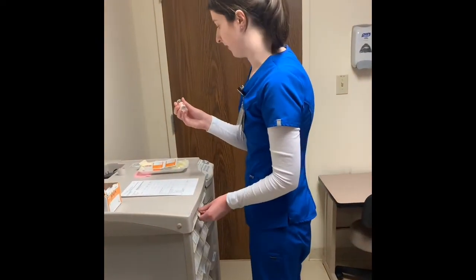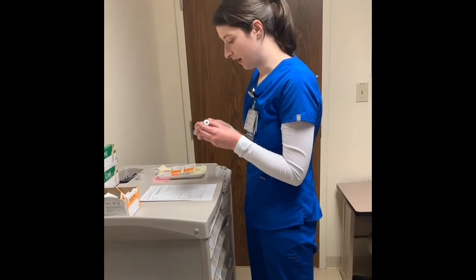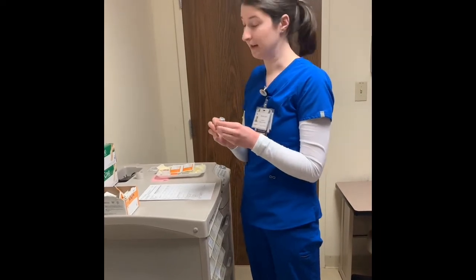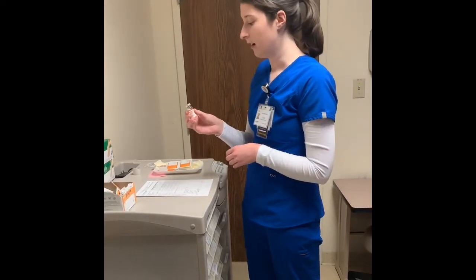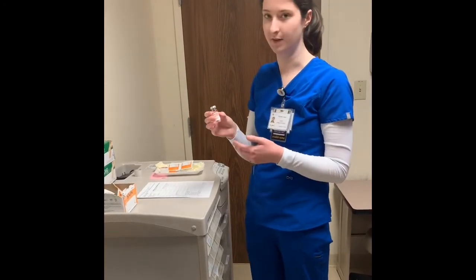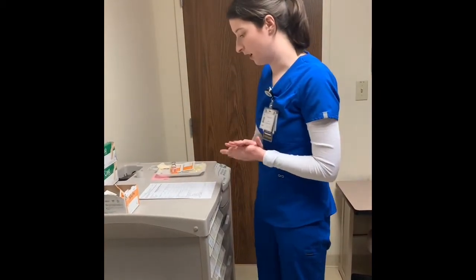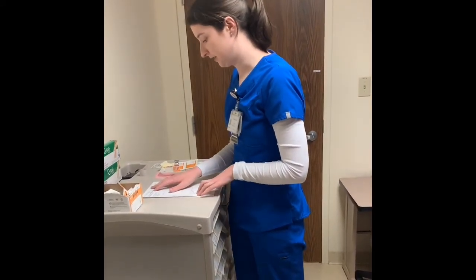Here I have a vial of regular insulin, which is what we need to be giving right now. And the expiration date on it is May of 2026, so it is not expired. The vial is intact, it's not broken, so there's nothing compromising the integrity, so the medication in this vial is safe to give.